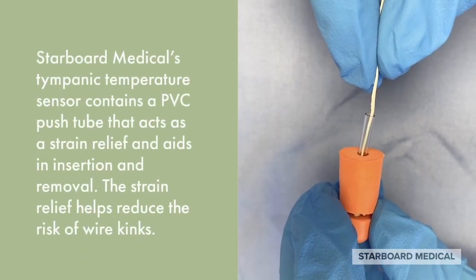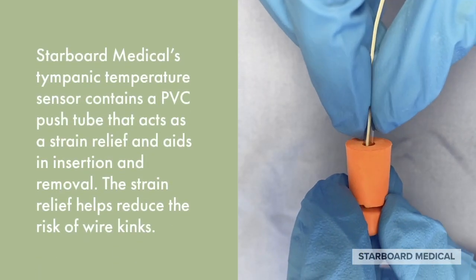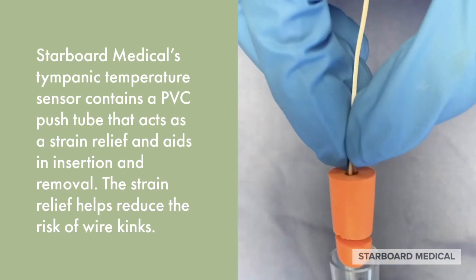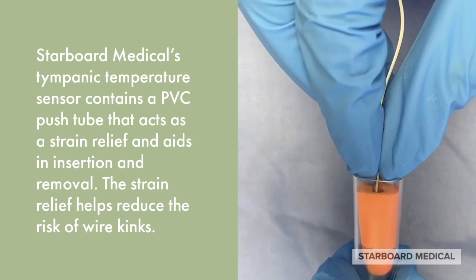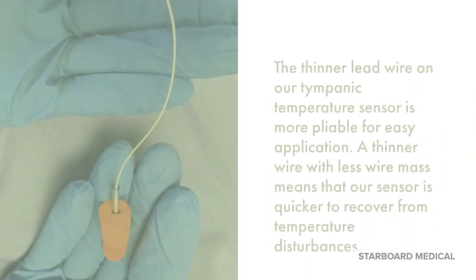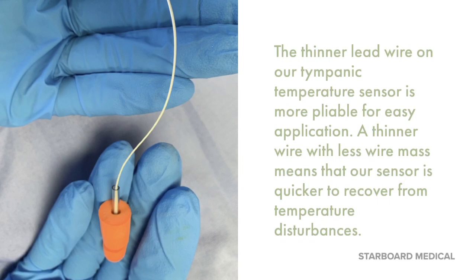Starboard Medical's Tympanic Temperature Sensor contains a PVC push tube that acts as a strain relief and aids in insertion and removal. The strain relief helps reduce the risk of wire kinks. The thinner lead wire on our tympanic temperature sensor is more pliable for easy application.